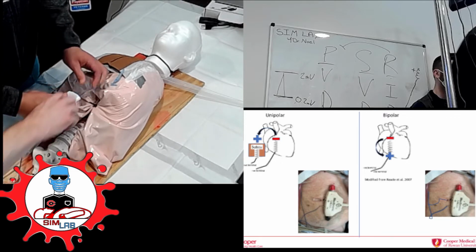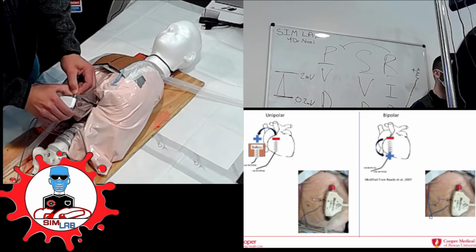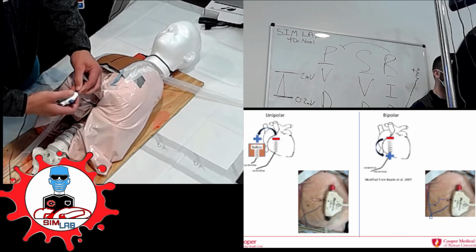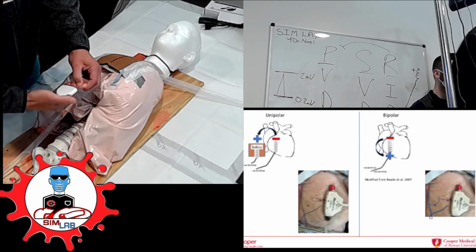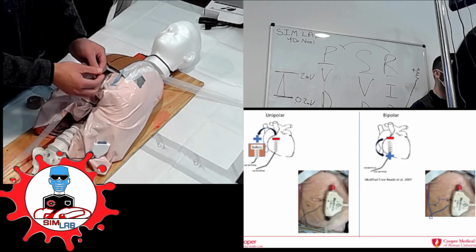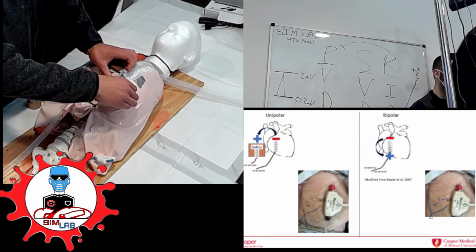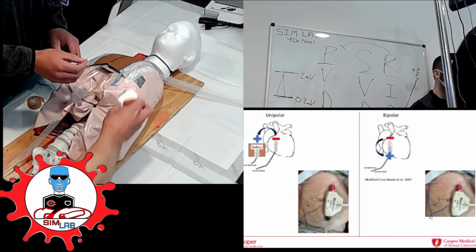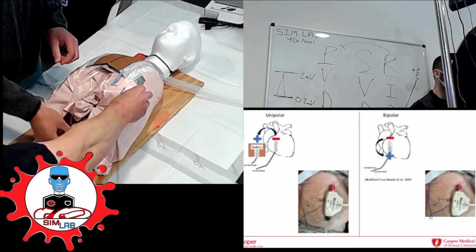You have to press it down. Still messing up. Do you wrap this around? No, it's simple. All you do is put the needle into here. Oh, okay.